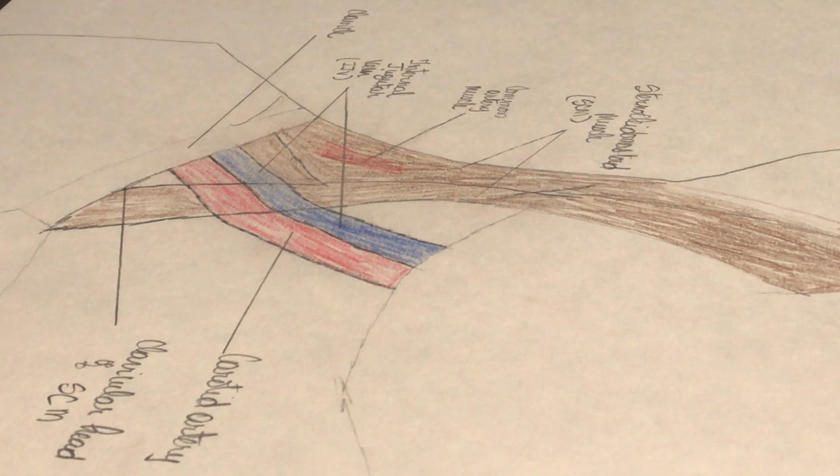Before we start the procedure, we have to make sure that we obtain informed consent and that we explain the associated risks of this procedure to the patient. The risks are infection, air embolism, nerve injury, arterial puncture, hemothorax, and pneumothorax.